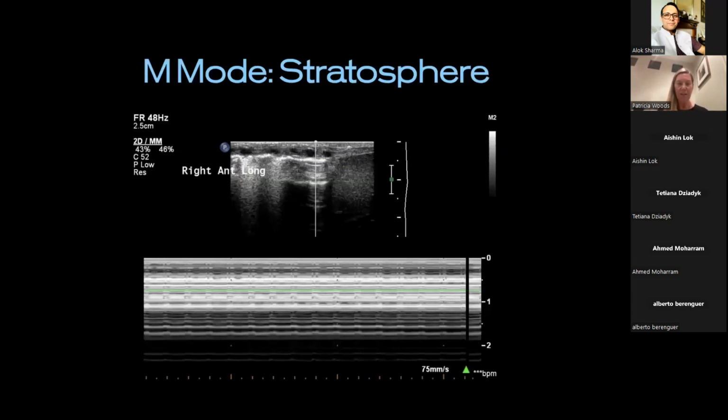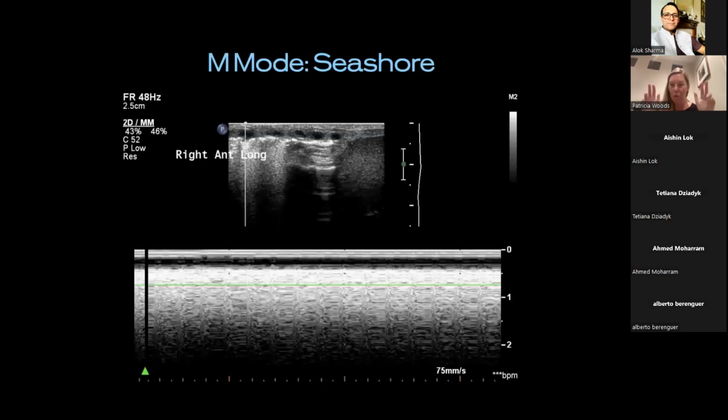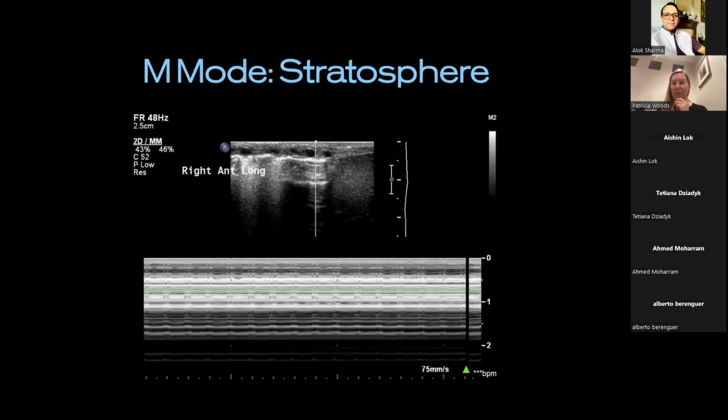So let me go back. You get a recognition of what's normal for this baby with this B-line coalescence and not a lot of movement of the chest wall, but really artifact dominated from the jet, and then flicking to the area of interest, completely different. Okay, without a question of a doubt, I'm getting scrubbed and ready. I know this baby's 500 grams, starting to be compromised. I think what we've done here is diagnose with absence of pleural sliding, thin defined pleural line, lung point, and the change in presence, absence of B-line artifacts, and very strong clinical suspicion.